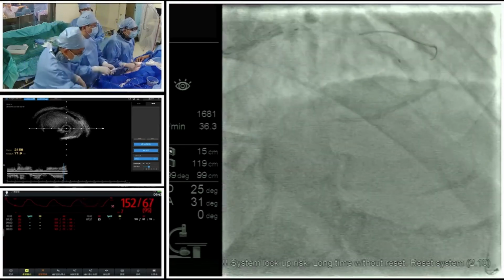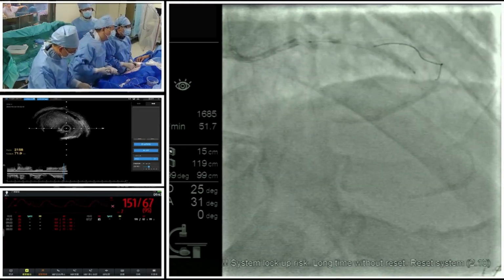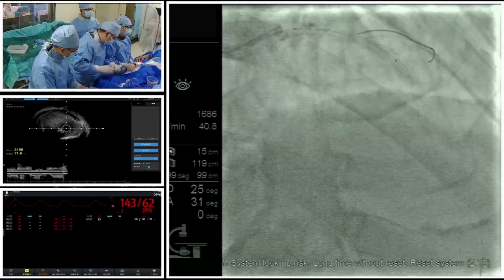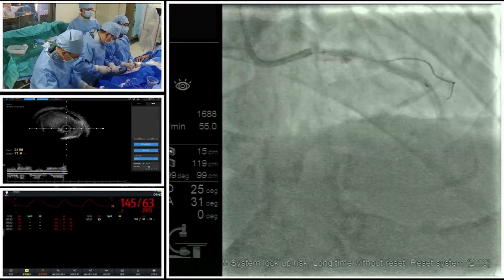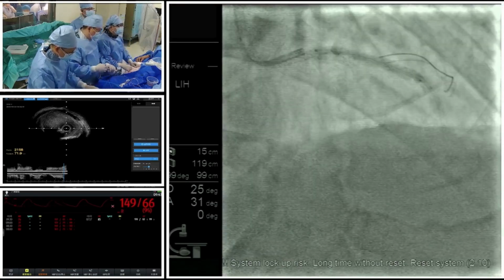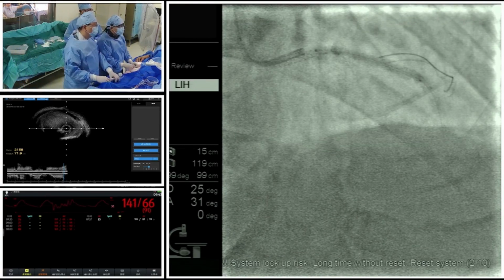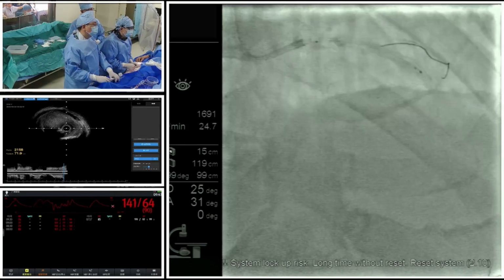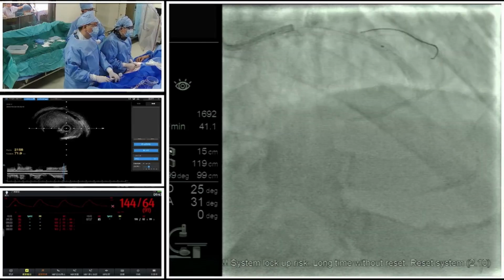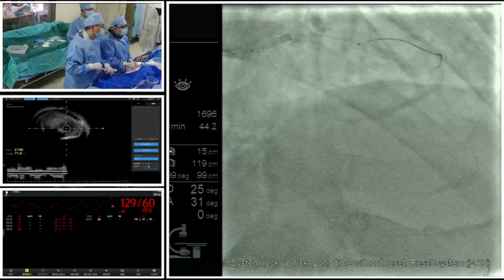Yeah. So right now we have more weapons to fight against calcification. If we do not have the IVL, maybe after the use of rotational atherectomy, we can use some balloon-based technologies to treat the lesion. I think it should be fine. But right now we have better techniques. Why not use it, right? That's why I think you choose the rota and lithotripsy strategy. This is a very good choice.